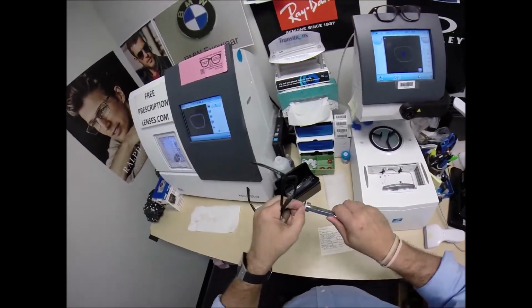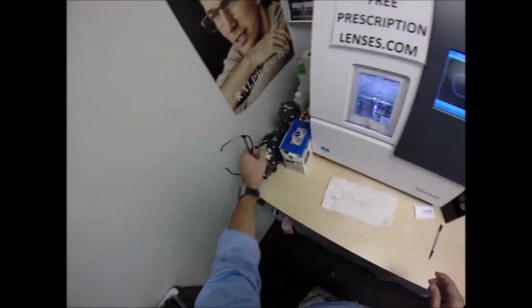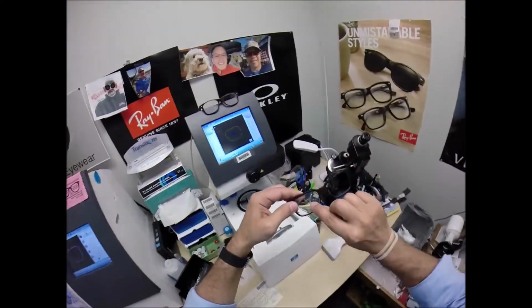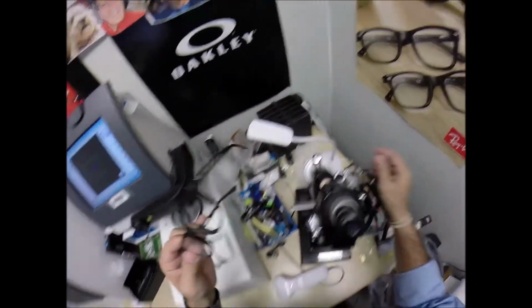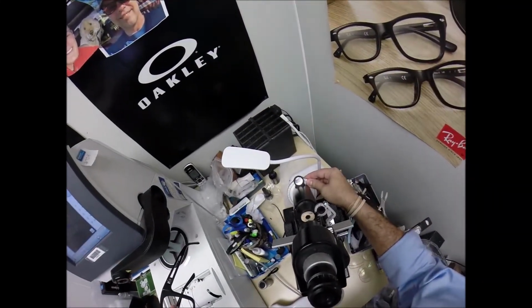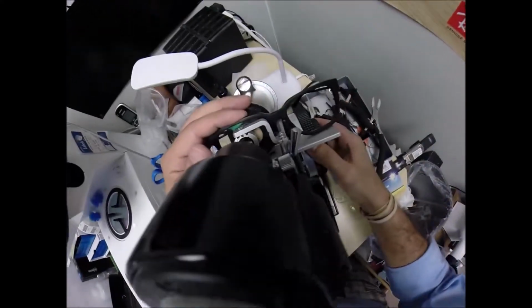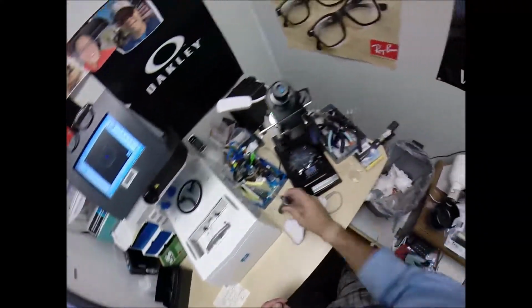I'm going to take this block off. I'm going to use my hand-approved drying method. Throw that back in there, add to my sticker collection. We're going to come down here to the lensometer, turn the axis wheel back to 002, place it in over that black dot, and read the power. Actually, I don't even have to turn the power drum.